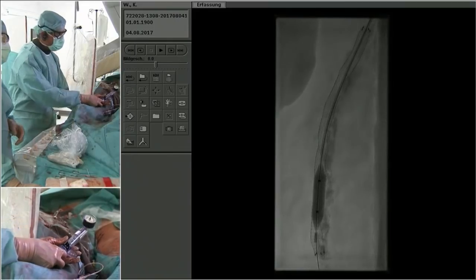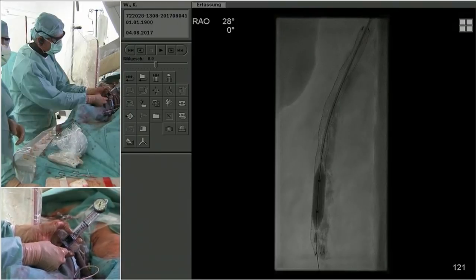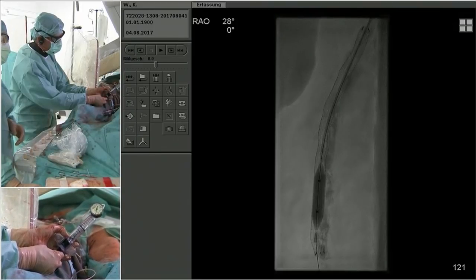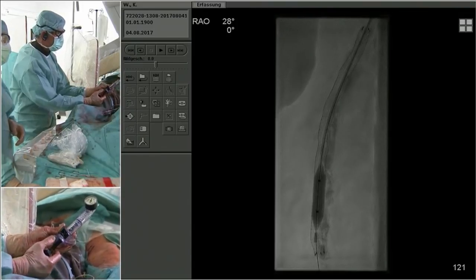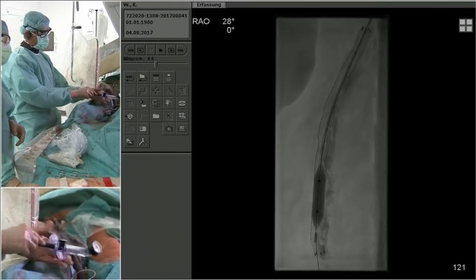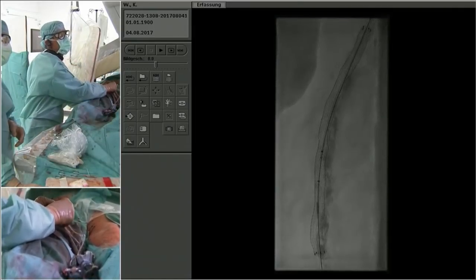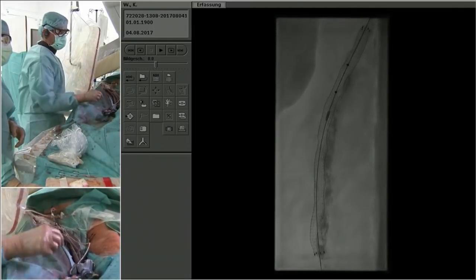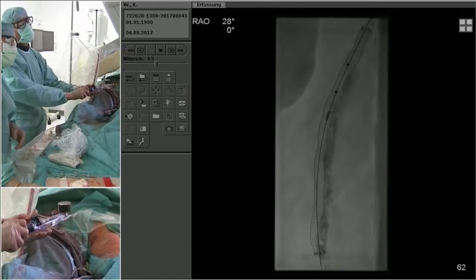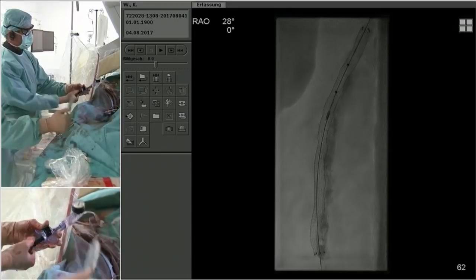What I was saying is sometimes it is hard to predict how distal the dissection plane extends. Would any of you use imaging and not just rely on angiography, because of the distal edge of the Viabahn? So any takers for imaging here, intravascular ultrasound? Or you would not incur the additional cost and you don't think there is great value to it? Munier, you? No, we use IVUS, but if this is good, no need to put another $1,800 really.